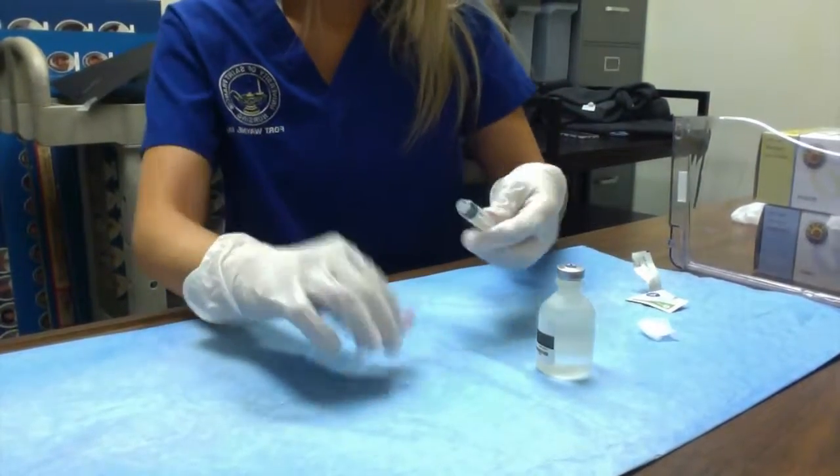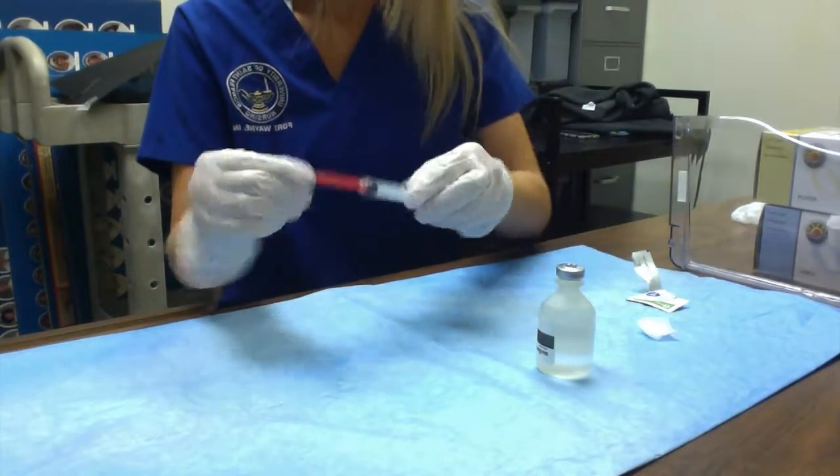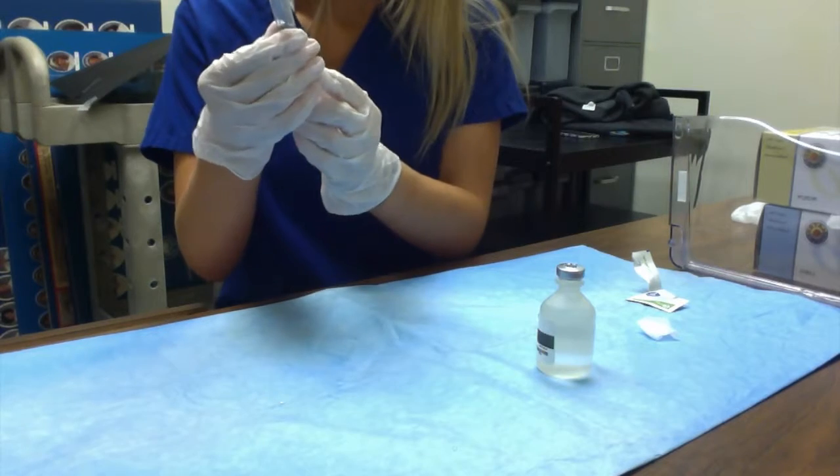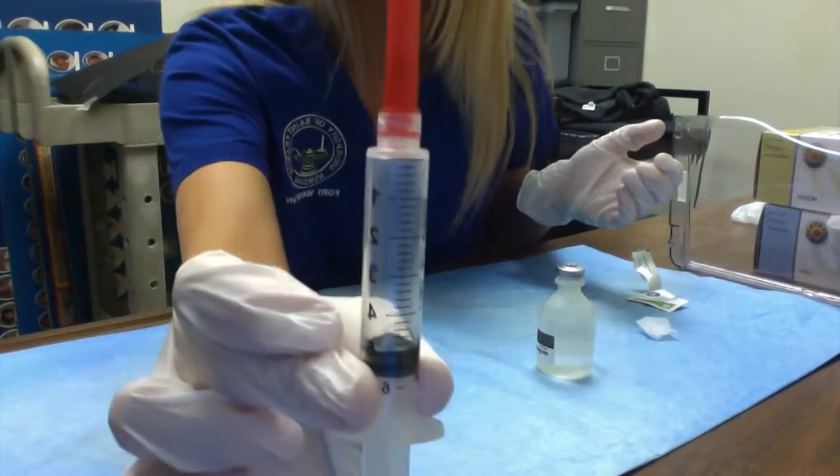Now I'm going to prepare my syringe. I'm going to screw on the non-filter needle and draw up five milliliters of just regular air — five milliliters.